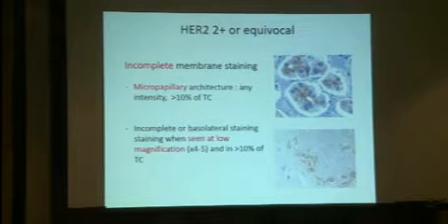And this staining was seen at low magnification, so it was at least 2 plus in terms of intensity, and in more than 10% of the tumor cells.